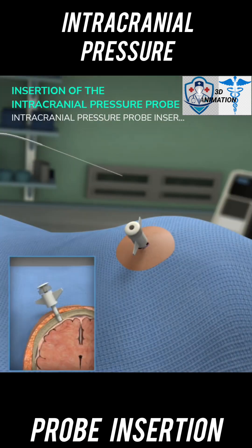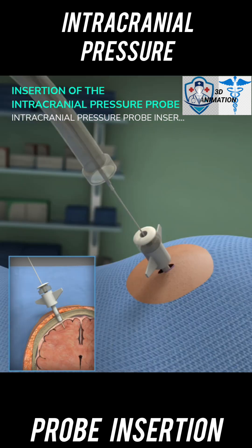Advance the probe into the bolt using the centimeter markings to gauge depth. Stop advancement once the 6 or 7 centimeter mark reaches the top of the bolt. This should place the probe about 5 millimeters beyond the end of the bolt and into the parenchyma. Slightly pull back on the probe, as this helps with accuracy of the pressure measurement.